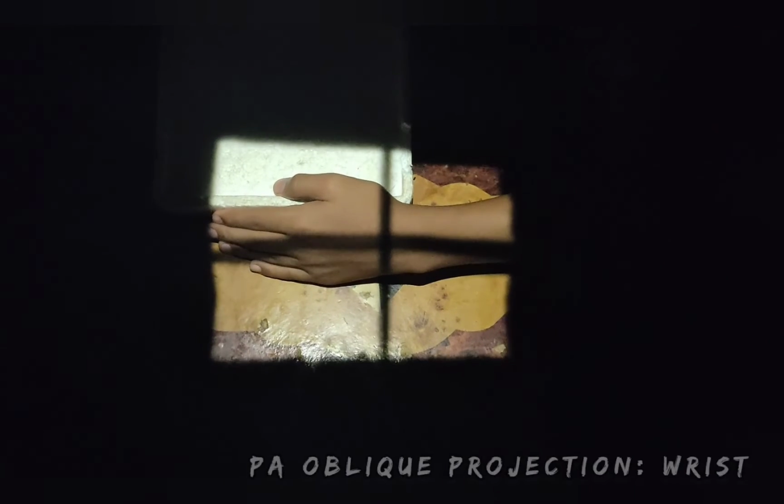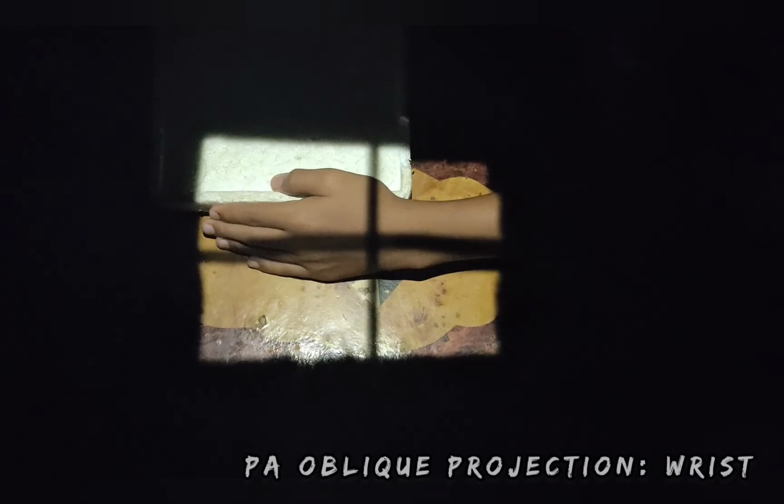PA oblique projection, wrist. Part position: palmar surface against the IR, hand pronated and rotated 45 degrees laterally, wrist in ulnar deviation for the scaphoid only. So the CR is perpendicular to the IR, directed to the mid-carpal area.